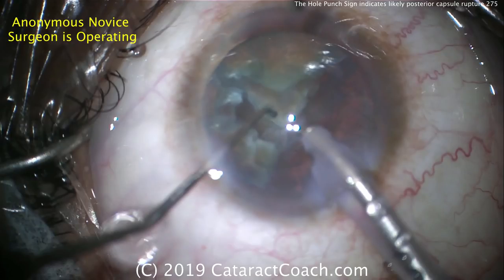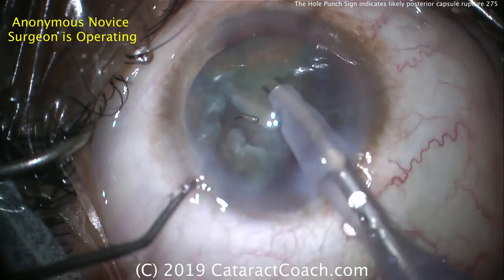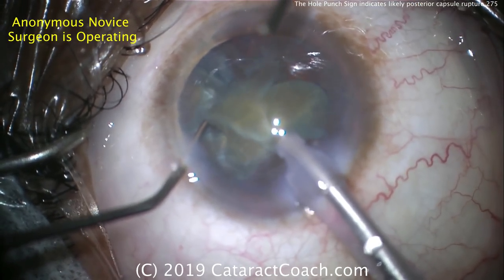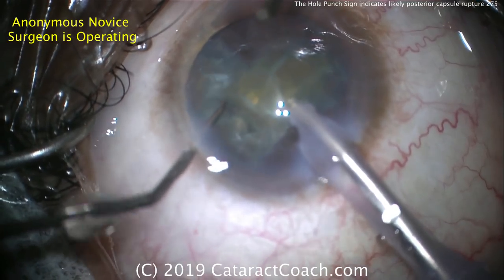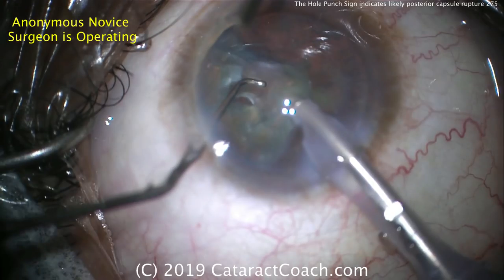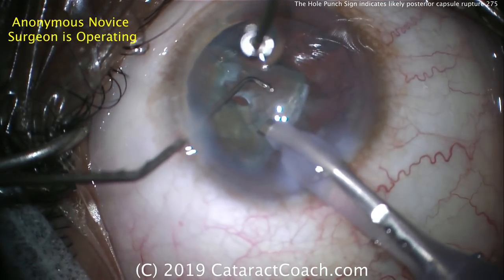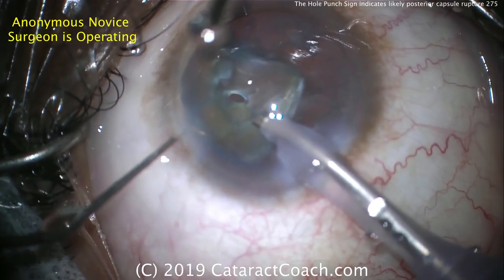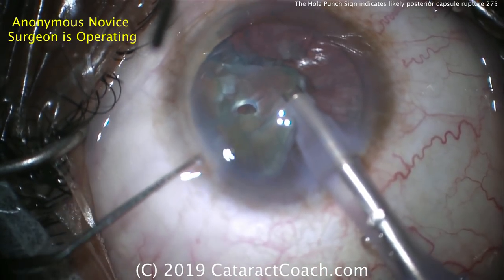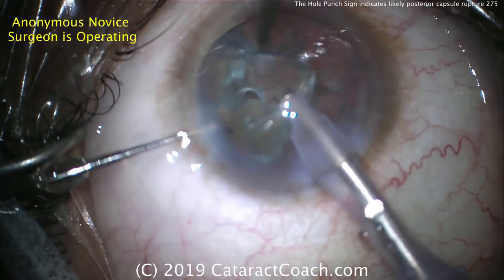Here's a second or third quadrant being removed — that looks good and will be removed without issue. Now the small hole in the posterior capsule is still being blocked or tamponaded by that last nuclear quadrant. There's that hole. At this point, when you see that hole in the nuclear piece, you know you likely have punctured the posterior capsule. That is the punch-out hole sign.